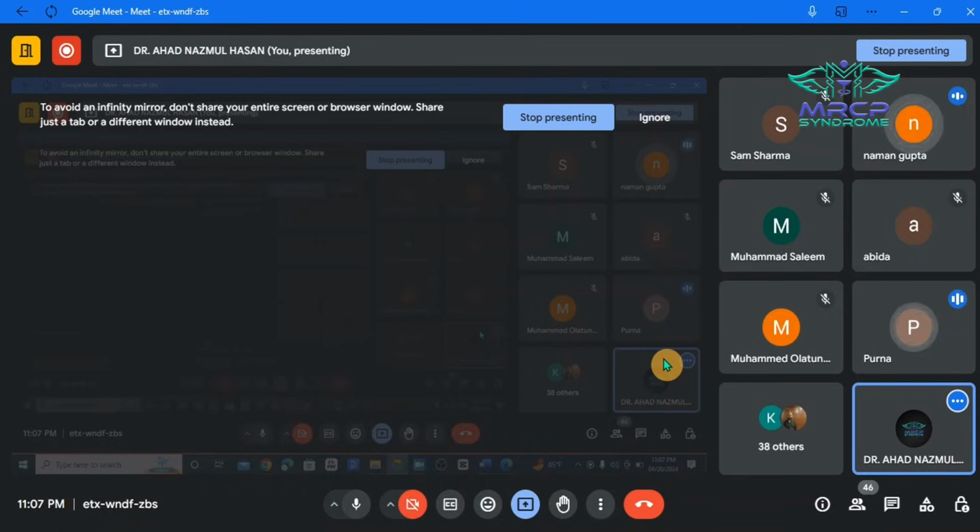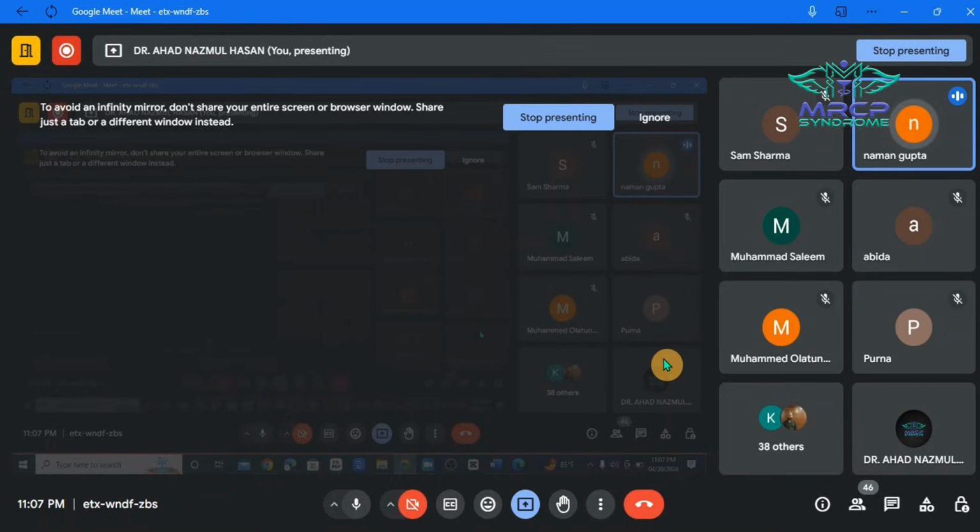Severe renal impairment. Soft tissue, it's not seen very nicely on CT scan. Only for hard structures, it's good. Yes, very good. So CT scan is usually good for the hard structures, especially the bony structures. Bony structures are easily visible in case of CT scan, but if we need the soft tissue structures, then we need to go for the MRI.